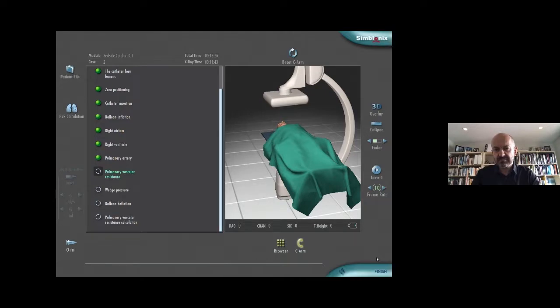I think you talked about it in the beginning. Yeah, and I can also say, if you're doing this at bedside, you do have to use ultrasound for your access site. I think there's really no question nowadays, to be safe, to really know where you're at, use ultrasound to confirm you are really in a vein. And you said it is right IJ, ultrasound guided approach, it increases safety to a great extent.